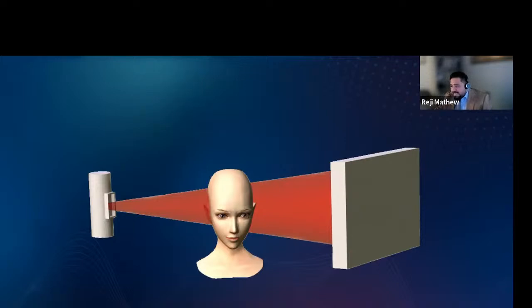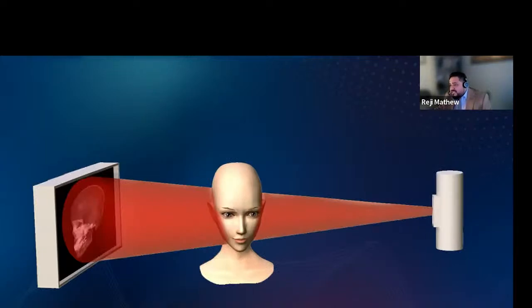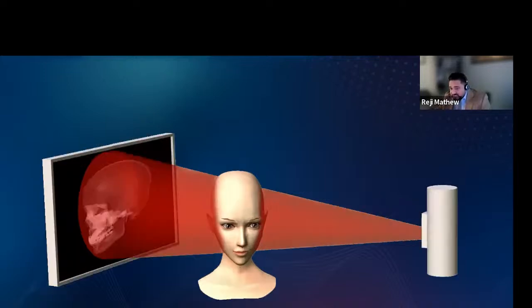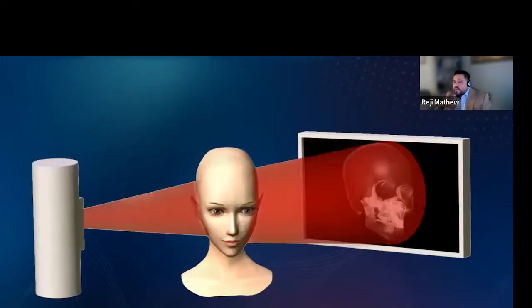I would call it as LAT-CEF and AP-CEF images. Again, the good part of this CBCT is that it's not continuous radiation. As it rotates around the patient, the radiation exposure is not continuous. It's given as pulsed radiation, so that the radiation exposure is less on the patient. Since we acquire the whole field of view, just one rotation is enough to get the images required for reconstruction.